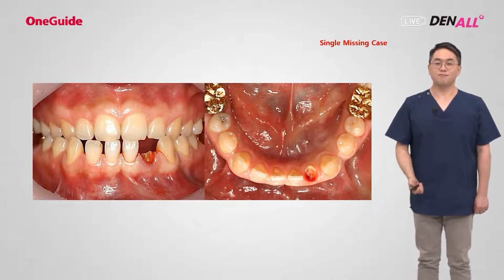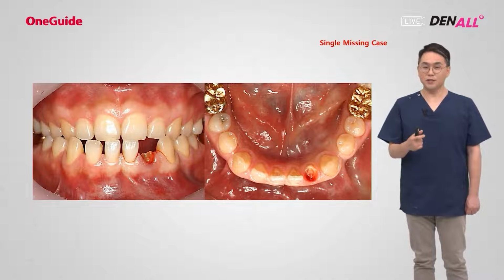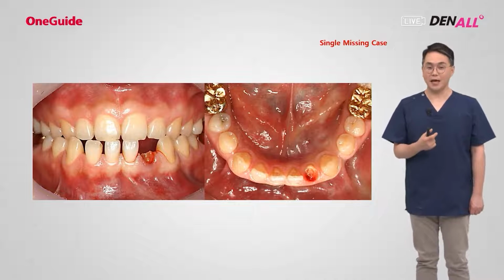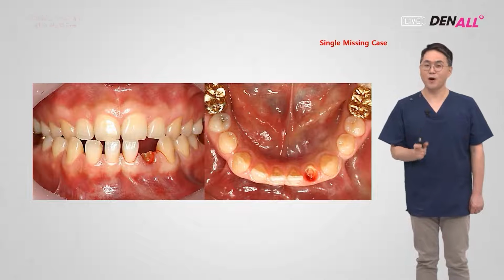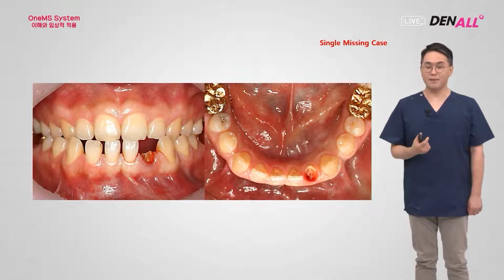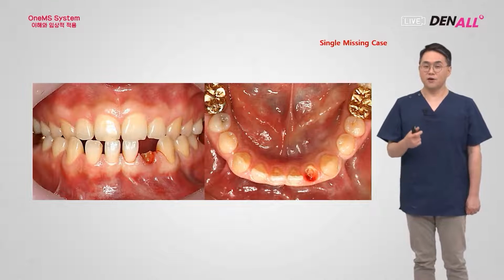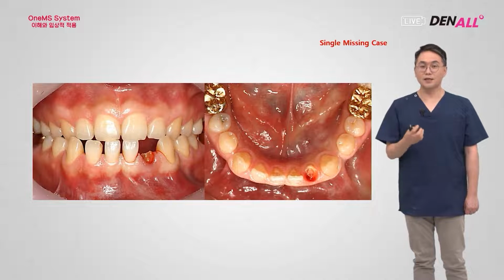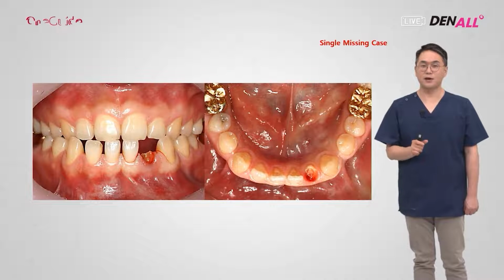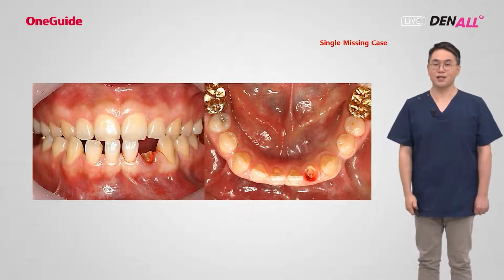So you can use a two-piece type implant, but on top of that, the abutment on the cervical side has a diameter of more than 4.0. For the adjacent natural teeth, with that mesiodistal distance, there's not much room, and it would be very much detectable. But for the MS implant, the diameter is 2.0, 2.5, and 3, so the abutment part is very slim. Hence, after making the final prosthesis, it will match very well with the adjacent natural teeth and the cervical side. That's why for this patient, I went with the MS implant.